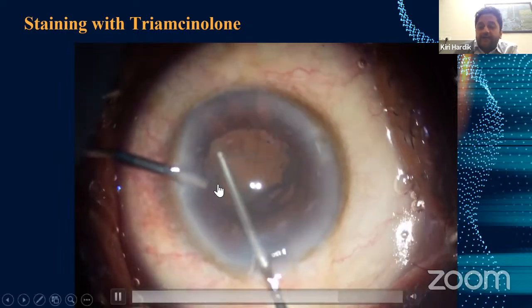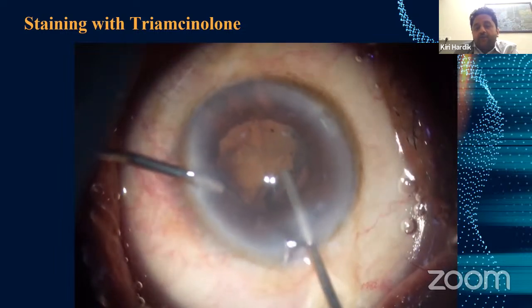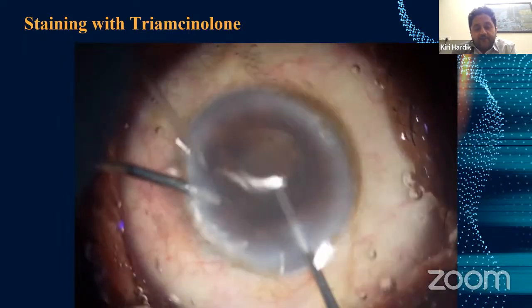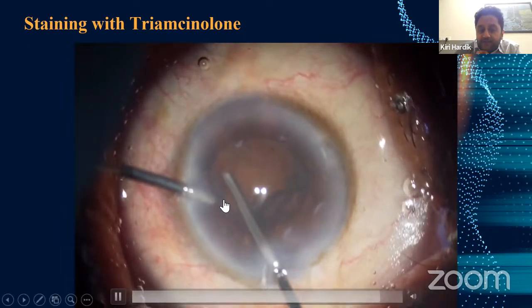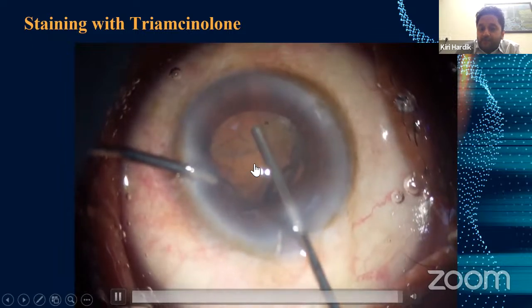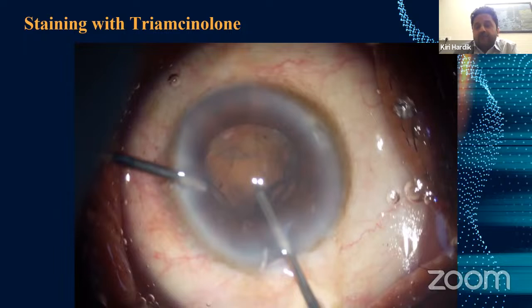Make sure that your irrigation cannula is staying inside the anterior chamber, and don't direct your irrigation cannula over the posterior capsular rupture, because the fluid can go into the posterior segment, which will again lead to an increase in pressure in the posterior segment and more vitreous will come prolapsing. So your infusion cannula should remain in the anterior chamber or be directed towards the angle. Just stay at the posterior capsular rupture, the vitreous will itself come into the vitrector and you will be able to do the vitrectomy. For the remaining vitreous, you have to move your vitrector and cut it. If there is any pupillary peaking, then you can identify that there is possibly vitreous there, and you can remove it.